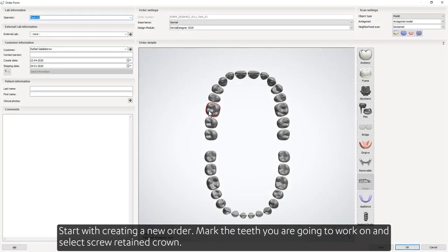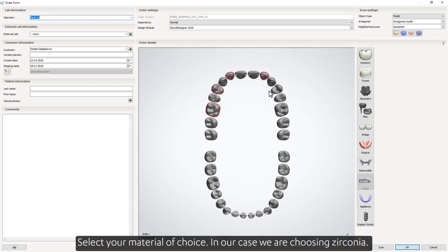Start with creating a new order. Mark the teeth you're going to work on and select Screw Retained Crown. Select your material of choice — in our case, we're choosing Zirconia.